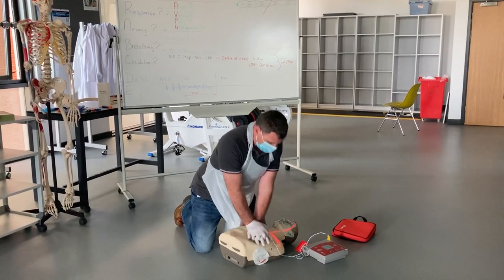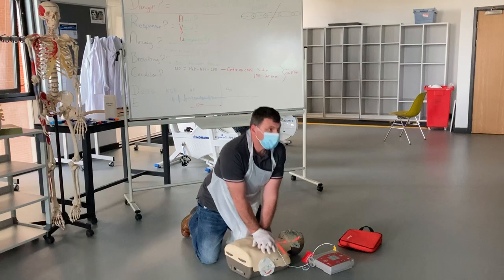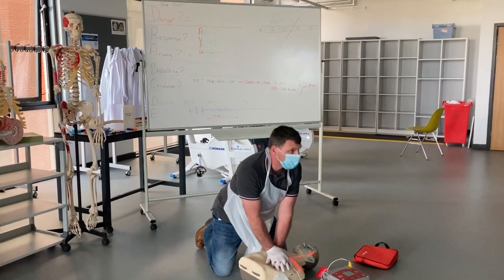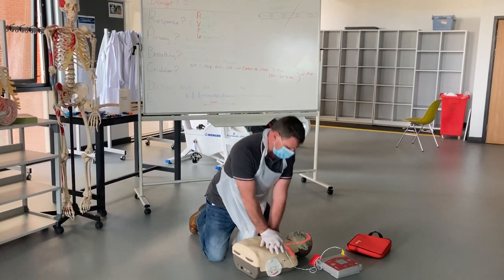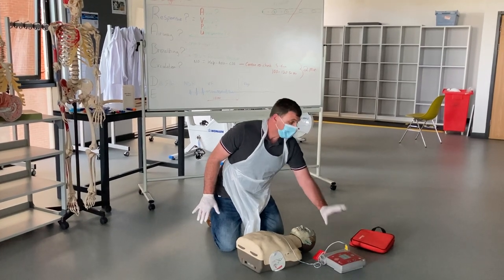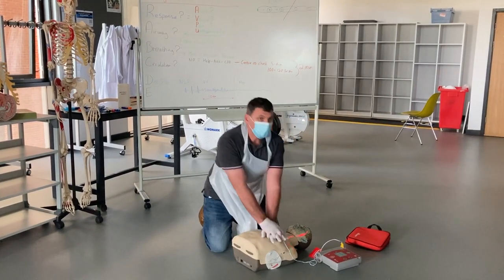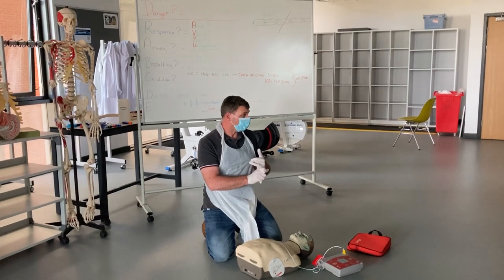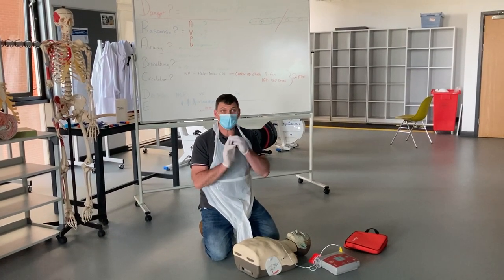After two minutes, I ask somebody else to come in and take over so I can rest. During chest compressions, the heel of my hand is in the center of the chest, pushing down five to six centimeters at a rate of 100 to 120 per minute. After another two minutes, the defibrillator says 'no shock advised' — I go straight back on the chest. There are only three occasions to stop CPR: a medical professional tells me to stop, the person is obviously breathing, or I'm too exhausted to carry on.